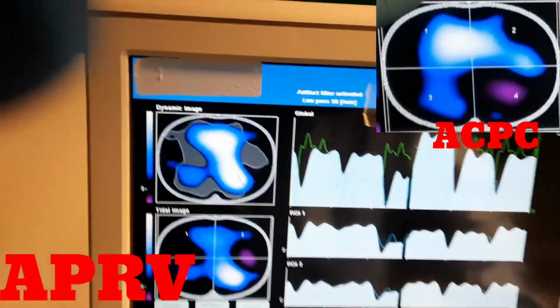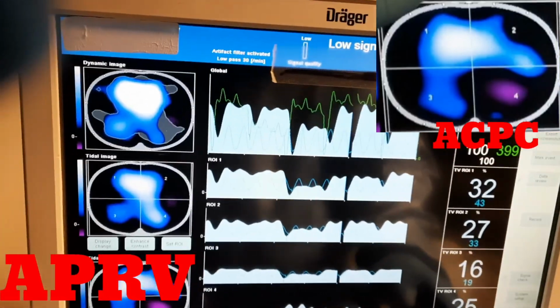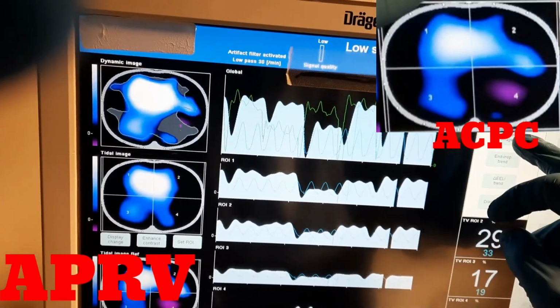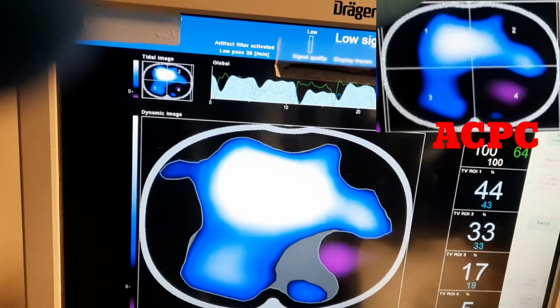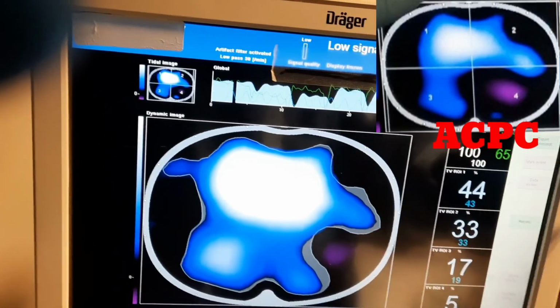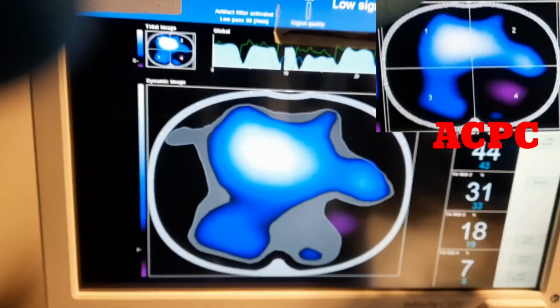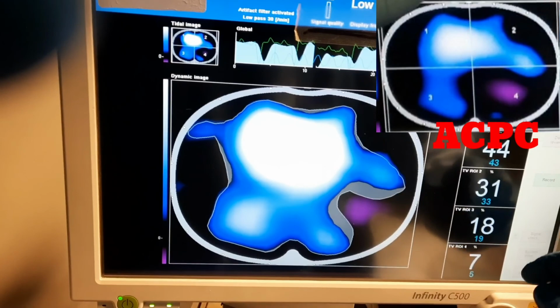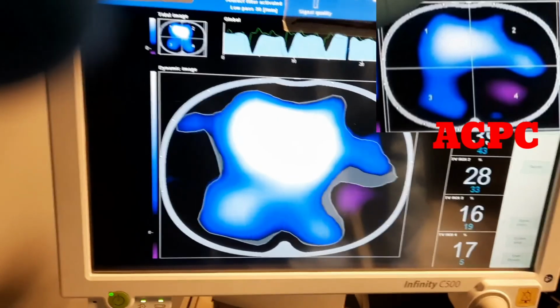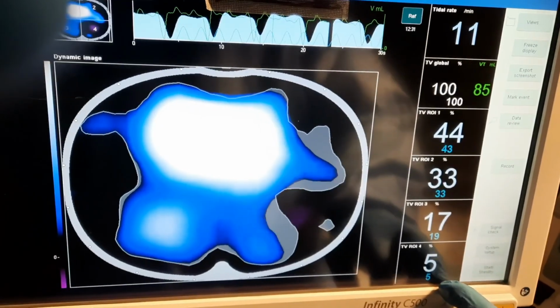It does manage to open it up sometimes here and hold it. That could possibly be beneficial over time, like you see here. Maybe I'm going to put it on full screen. Just wait for the next drop. So it could open up over time. It's not doing much for the oxygenation now.